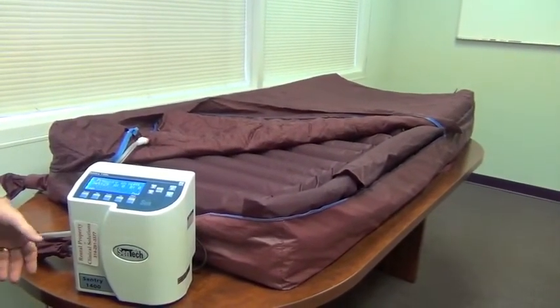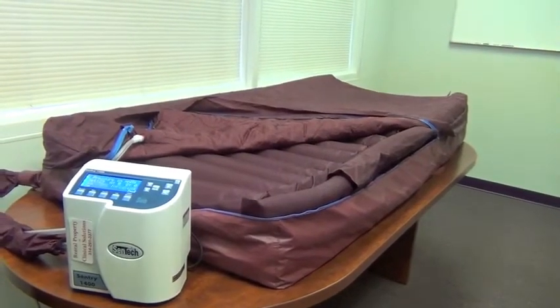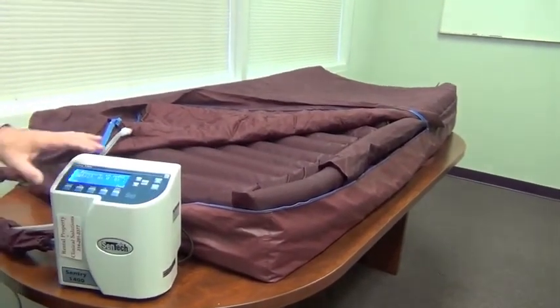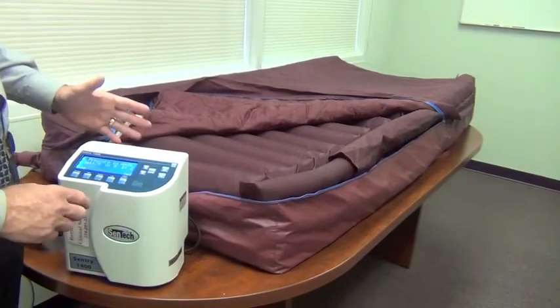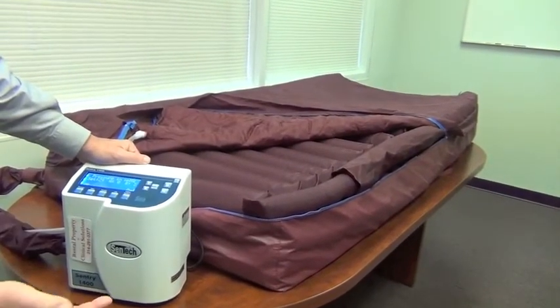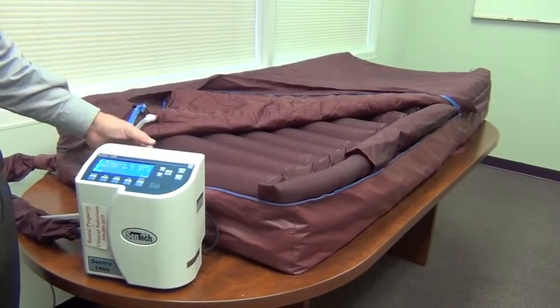You can allow it to fill passively, or if you want to hasten it, you can hit max and it will fill up a little more quickly. Remember, 30 minutes in max, it's going to kick out. So whatever therapy was set here is going to be maintained. That's something I want you all to understand. This has a memory, so whatever settings are placed in the system, the only time you would lose them or they would be changed is if it was a deliberate change on your part. If it's unplugged, if you have a power failure, if you're transferring from one area to another and you unplug this device, when you plug it back in, it's going to behave as though it had never been unplugged. Okay? That's the Sentry 1400.